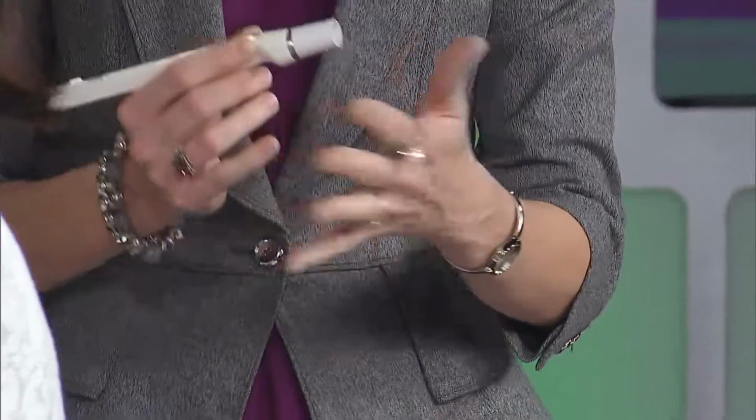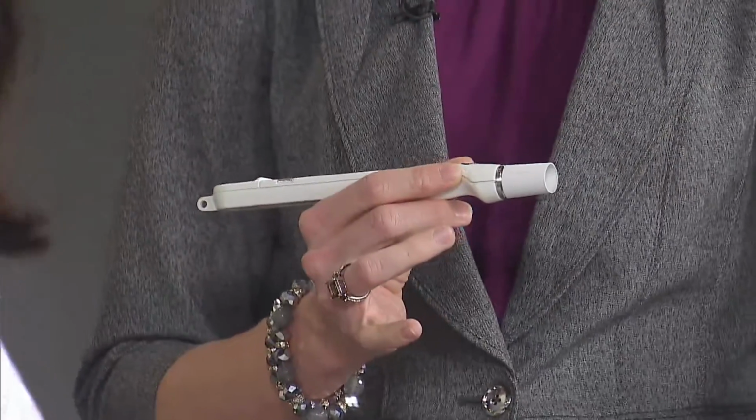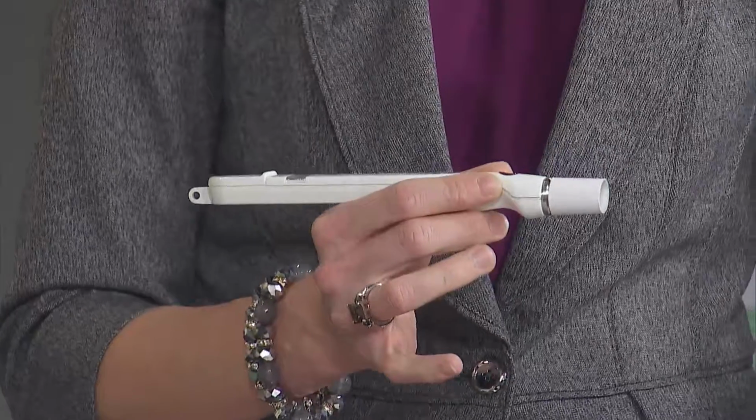Now what's this little toy? So this is one of the things I can use to check the eye pressure, which is something we do to screen for glaucoma. The slit lamp that I was talking about has a tonometer on it that is used to also check eye pressure. That's the most accurate way of doing it. But once again, if you're in a situation where either the person is not able to get into that machine or you're on the go, this is a way of checking eye pressure as well, and it just barely touches the surface of the eye, so you have to numb the eye up first to use it.